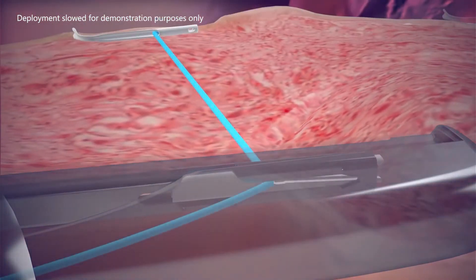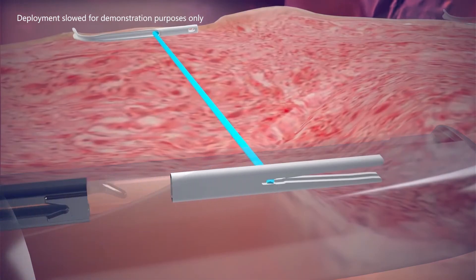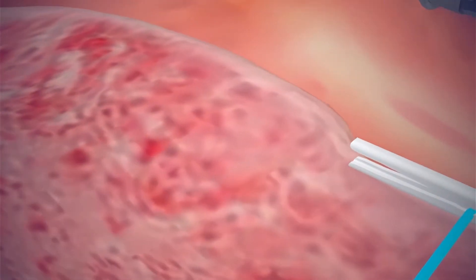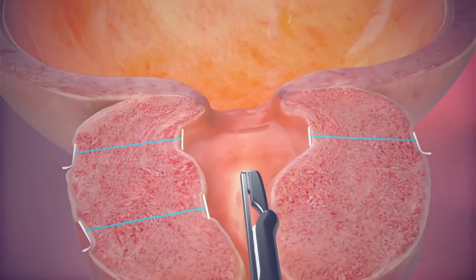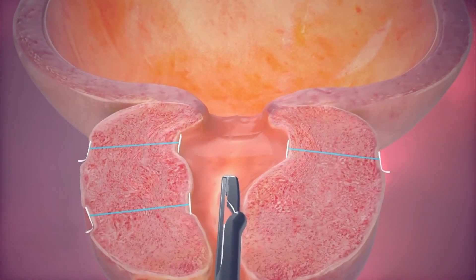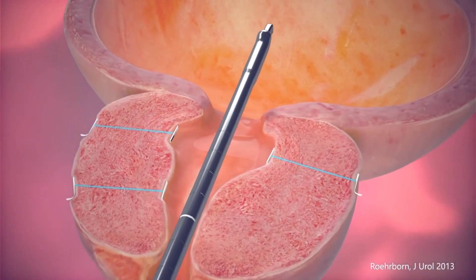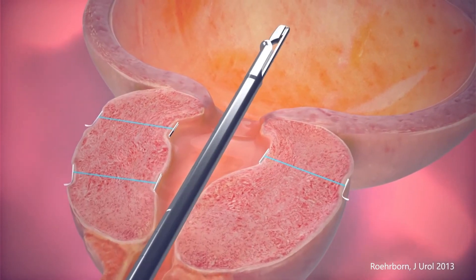The implant size is customized to each individual patient and prostate lobe. As the suture is tensioned, it also shortens, compressing the prostate lobes to the side. This reduces pressure on the urethra and provides immediate, visible results so urine can flow freely. It's a mechanical solution to a mechanical problem.